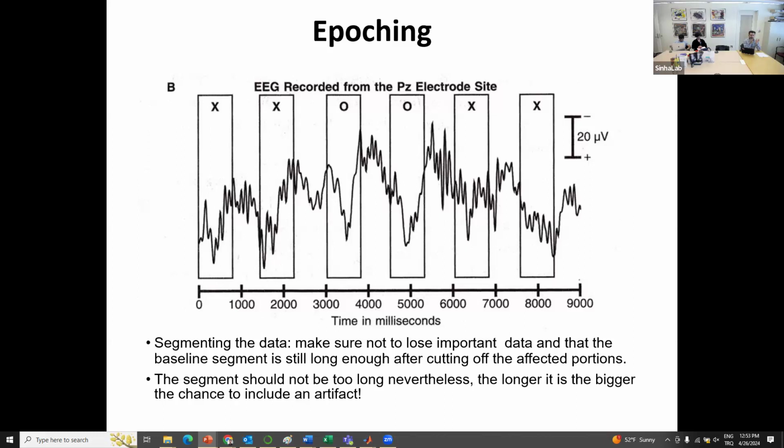However, if you go beyond 1 second, then the phase difference between these frequency components is so large that when you add them together, the signal is no longer reliable. That is due to this phase difference of not just the brain signal, but also the external signals that are contaminating your original signal. It could be due to the eye, or it could be due to other background jobs the brain is running.